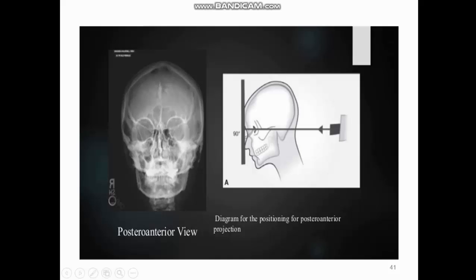This is the posterior anterior view and the principle of taking this view. With the help of this method we can investigate fractures of the skull. Also we can investigate the frontal sinus and conditions affecting the cranium, particularly Paget disease, multiple myeloma, hyperparathyroidism, and intracranial calcification.